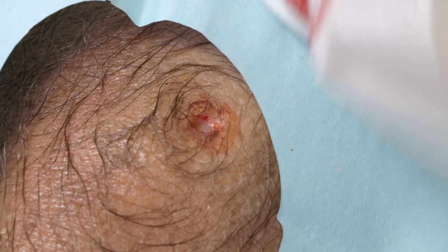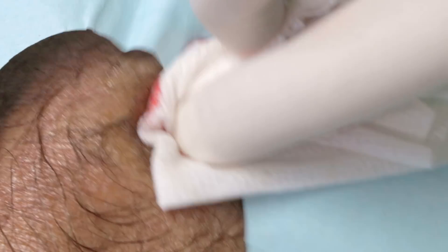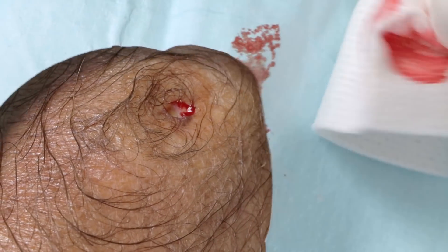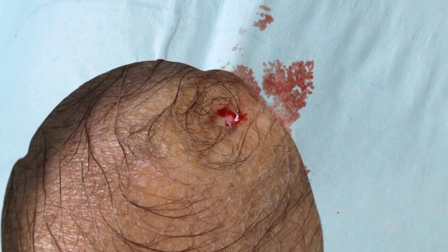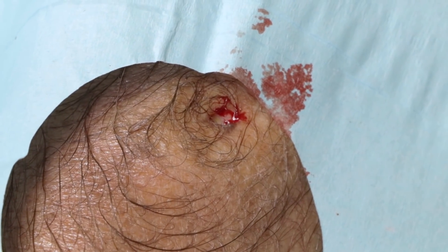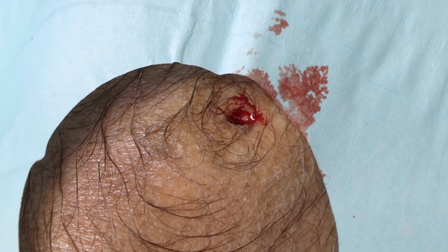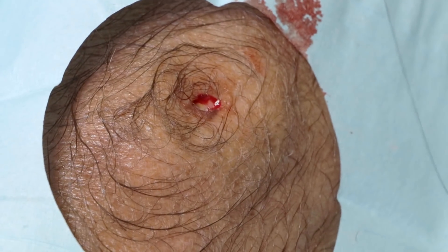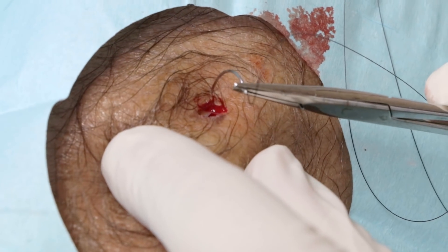I went all the way through the skin. How many millimeters? Between one and two millimeters. But it looks deeper because once you get through the skin, the connective tissue underneath is very soft stuff — it's made up of fat and other tissues called connective tissue, and they're just kind of loose down there.